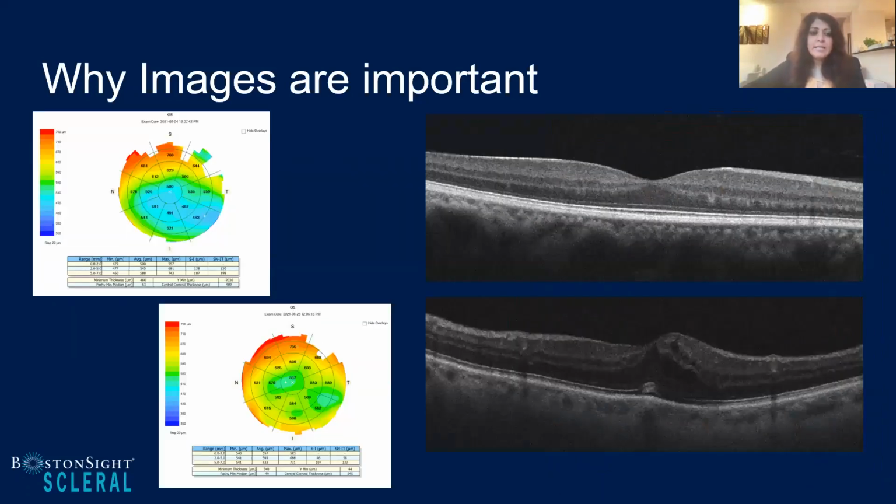So I had a case where this man came to see me post PKP, had a corneal transplant in his left eye, and he needed to be fit with a scleral lens. And we were sailing along beautifully with this fit. And then all of a sudden his VA drops, and I had no idea what was going on. So I start looking, take the lens off, first of all, and then I start looking at the cornea, and I notice right away that the cornea looks a little hazy. So I check the cornea, I check the retina, and I did have corneal edema.